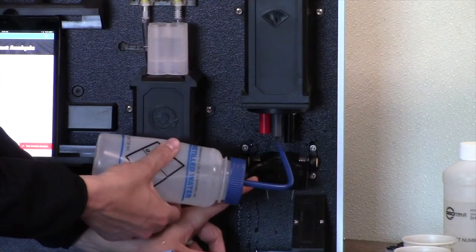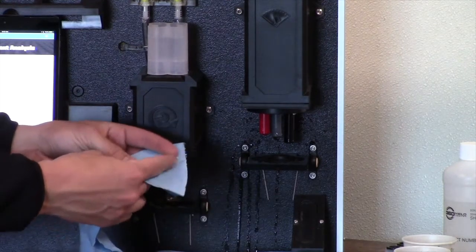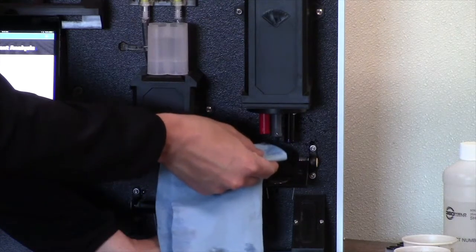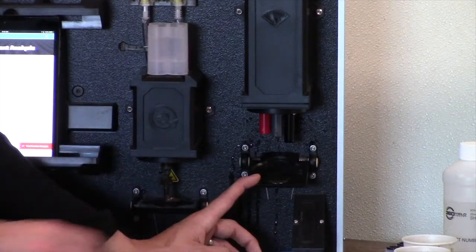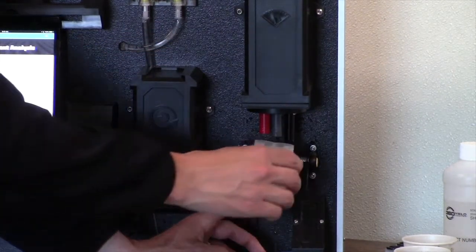So I start by spraying water up on each one of the sensors. And then when I go to clean off the water, I start with a dabbing motion and make sure that there's no horizontal movement, but yet it's just straight up and down. After doing that, you're done cleaning, and so place your solution back onto the sensor shelf.